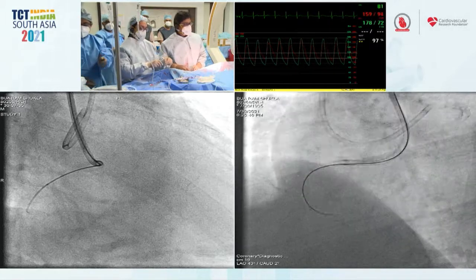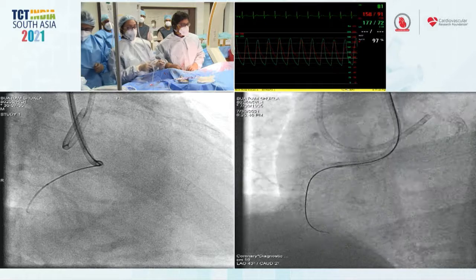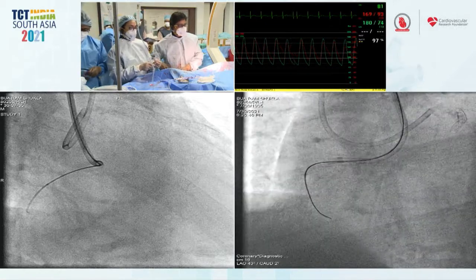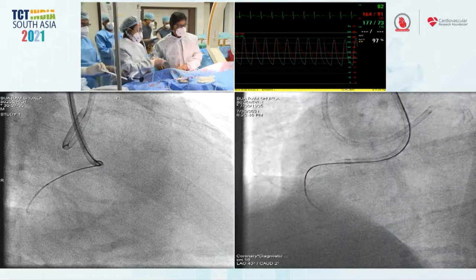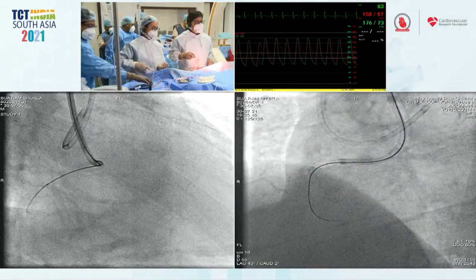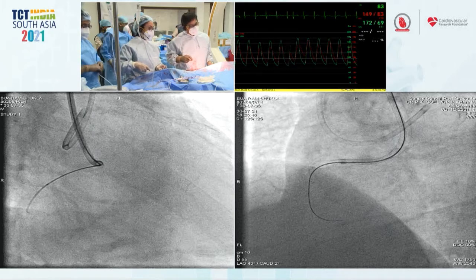A couple thoughts, Ziad, on Stingray-assisted ADR for hematoma management. And what wire do you like to deliver the Stingray down on? I used to use Miracle Bros, but recently I've been doing it quite successfully with a Mongo because it's just simpler and easier because it's often there in the case.